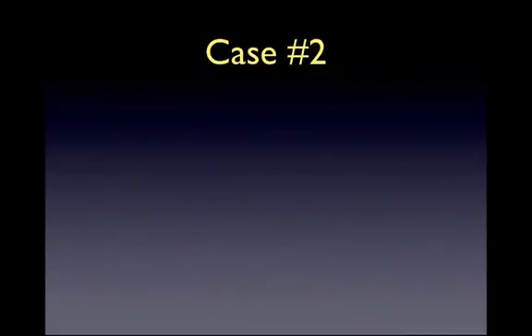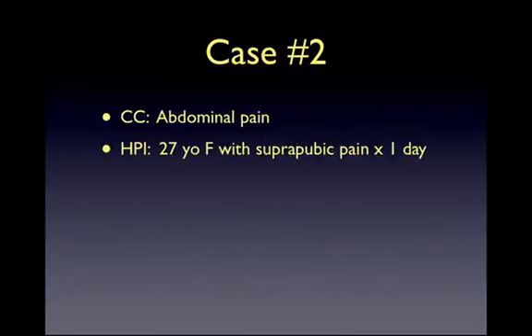Now that we've discussed the technique for transabdominal pelvic ultrasound and some of the literature supporting the use of bedside ultrasound in first trimester pelvic pain and bleeding, let's move on to our next case.